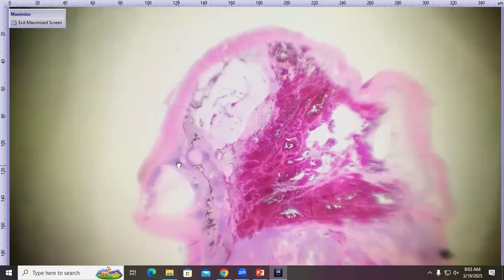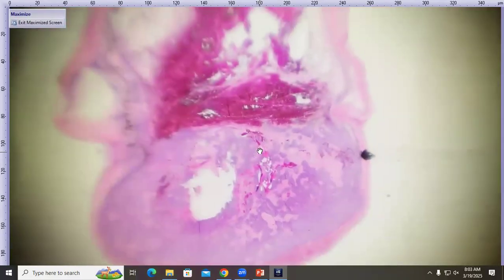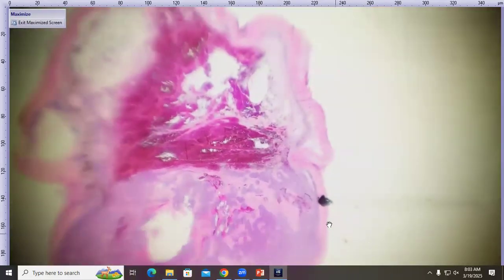One thing you can appreciate is that even in the more recognizable uvea, there are these multifocal areas of purpleness or basophilia, and those are areas of cellular infiltrate. The mass itself is quite purple, but it also has these coalescing areas of pink, and those are necrosis of the neoplastic cells. So I'm just going to tell you right now, this is a neoplasm. And then much like the gross photo, we can also appreciate that scleral wrinkling, which once again is consistent with phthisis bulbi.